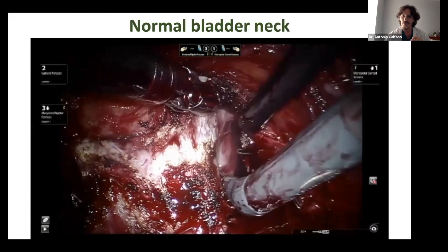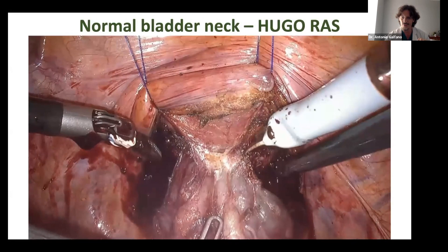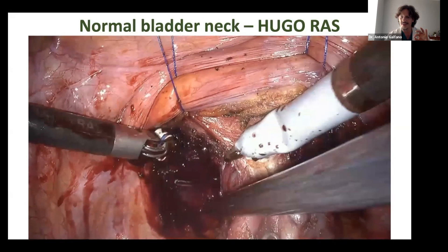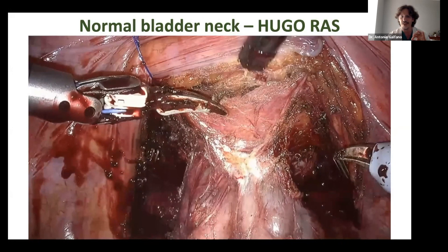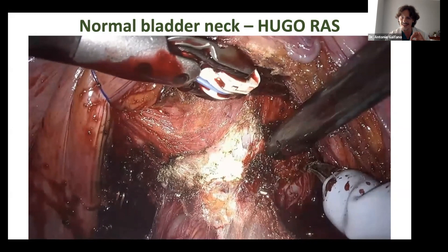This is a video of a Da Vinci view, but I also want to show a normal bladder neck with the Medtronic view. This was the very first case we performed — a quite quick and normal bladder neck. You have the retrotrigonal layer, and you will see that some small vessels are bleeding, which is quite usual to see on this view.